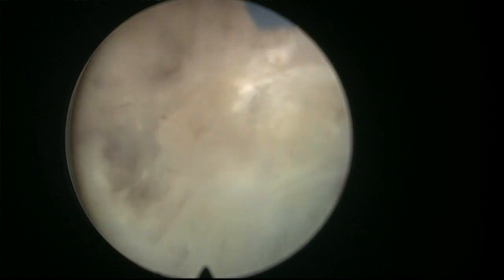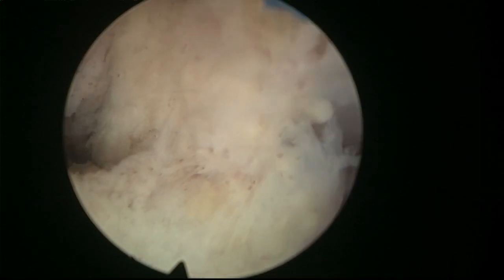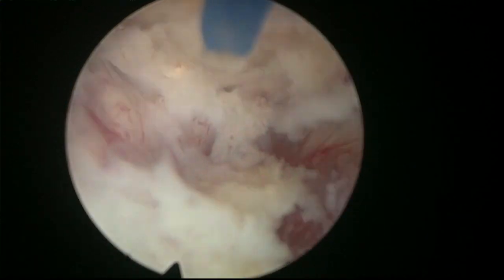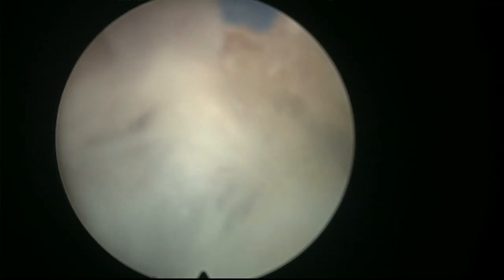Now we can try to, let's say, conquer the peak of the adenoma at 12 o'clock. So progressively coming up. But after having released the sphincter from the apex in the most distal part, no? This is again a little bit of tissue at the apex coming towards 12 o'clock. See, here is maybe, in a case like this, maybe with Moses, you would have the same initial bleeding, but maybe the control of hemostasis would be a little bit better, or easier, no? Just doing the same work and doing the same steps, you know?